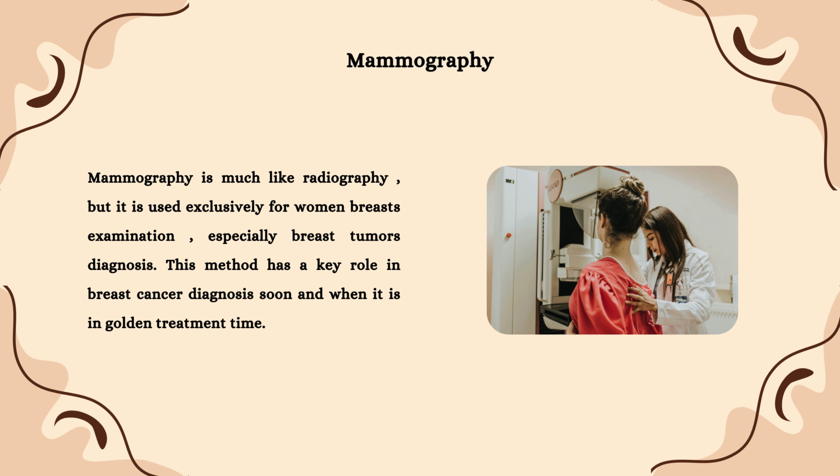Next method is mammography. Mammography is much like radiography, but it is used exclusively for women's breast examination, especially breast tumor diagnosis. This method has a key role in diagnosing breast cancer early, when it is in the golden treatment time.